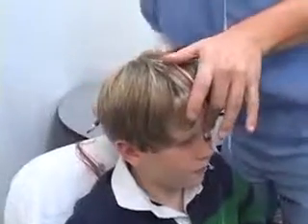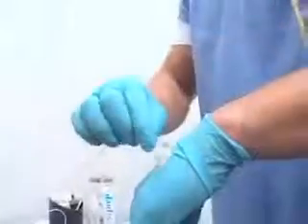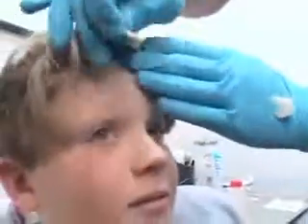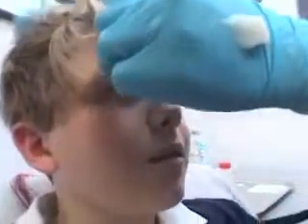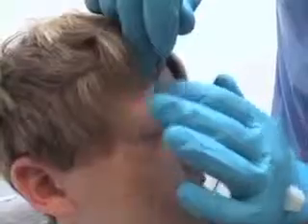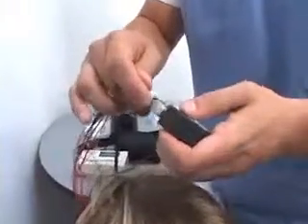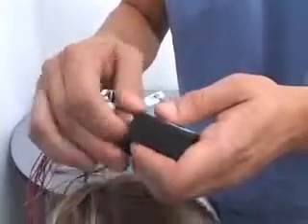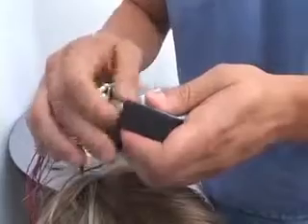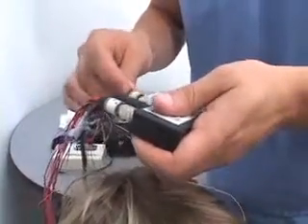First, the head is measured and marked to ensure proper electrode placement. 16 to 24 electrodes will be placed on your head using a conductive paste and special glue to hold the electrodes in place. But don't worry, the paste and glue will be cleaned from your head at the end of the test. Your electrodes, which are simply small metal discs with thin wires, will be connected to a miniaturized head-mounted amplifier, which collects electrical signals produced by the brain.